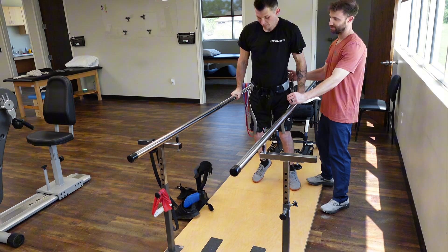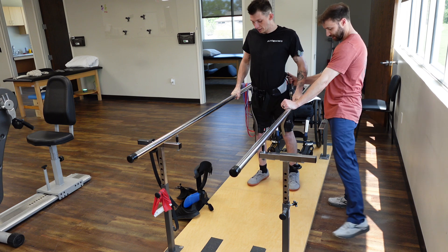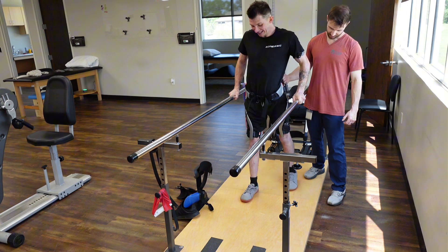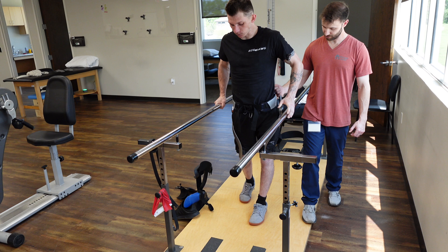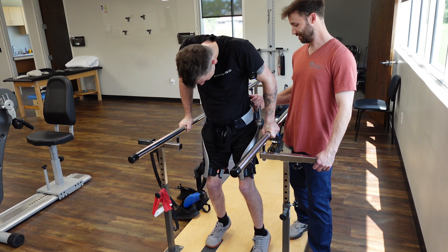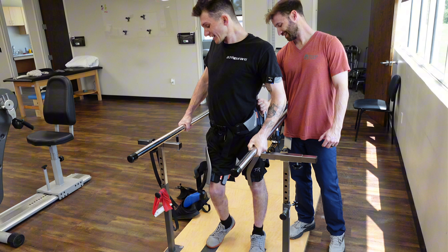You almost have to keep your feet wider apart for where you have to land, because you have to kind of... circumduct. Ten points for using circumduct properly. Squeeze — let's go! You've got to get up on the tippy-toes to make that happen, but it's happening.